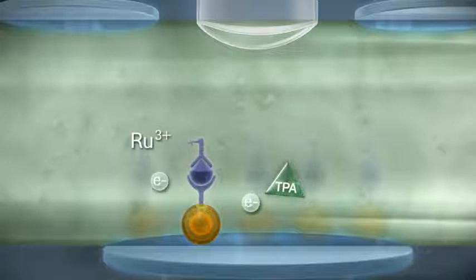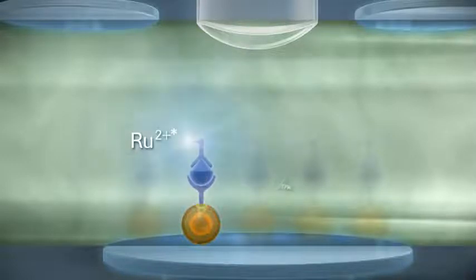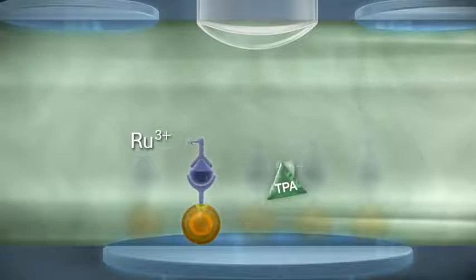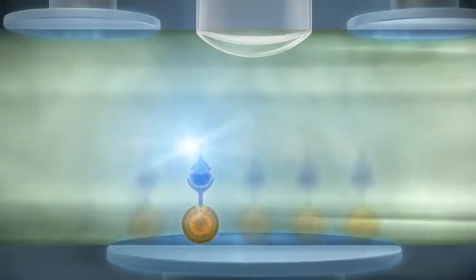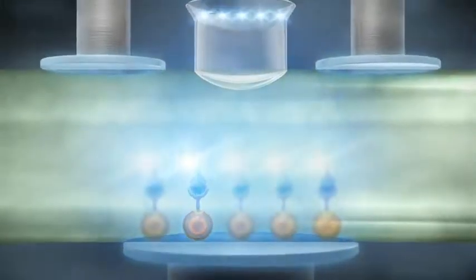Voltage triggers the ECL reaction. Ruthenium and TPA are excited in the process. The TPA radical then serves as a reductant, enabling ruthenium to return to its base state with the release of light. The electrochemiluminescence cycle repeats as long as voltage is applied, resulting in amplification of the light signal. The emitted light is detected by a photomultiplier.